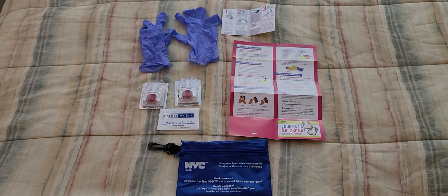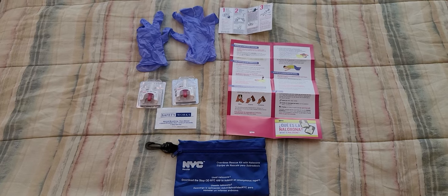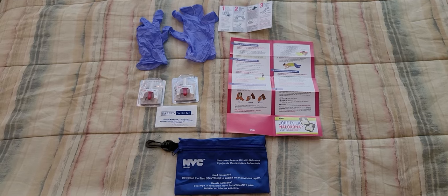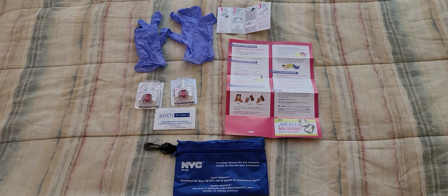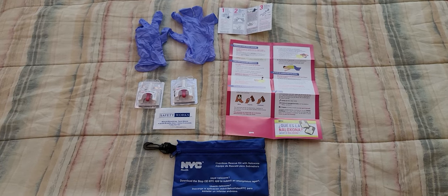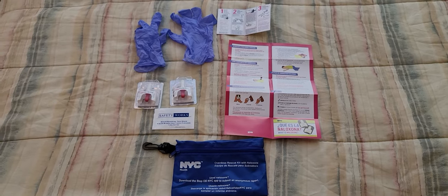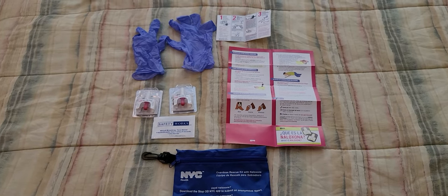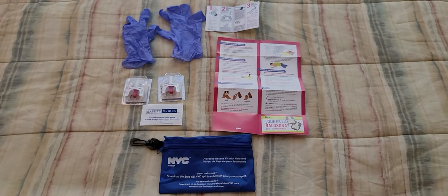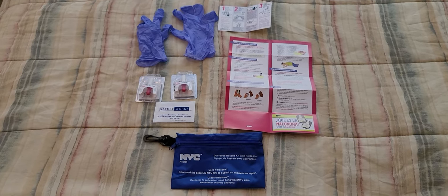They give this kit to anybody that wants to learn — in school, homeless shelters, or if you want to become a firefighter, police officer, EMT, or EMS. Remember to always wear your gloves and the face mask while conducting this on somebody that needs help, and don't forget to call 911.